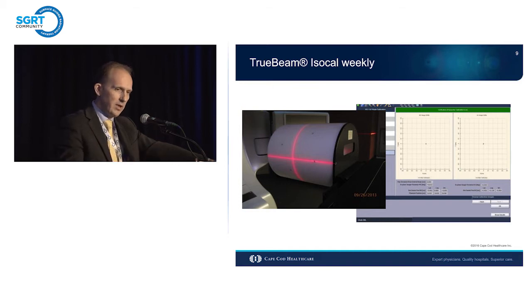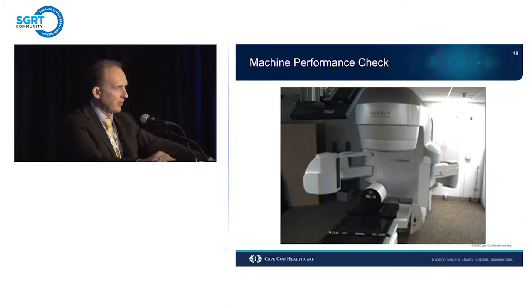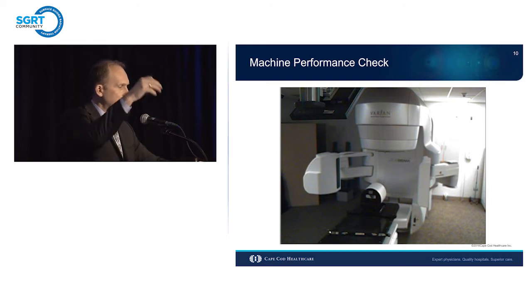And a great improvement in the latest releases of TrueBeam, around TrueBeam 2.0, 2.5, is something called the machine performance check. Now, this check in the morning, we kind of move away from the usual output check, flatness symmetry check, ISO-cal type check, because this module itself, using the MV imager, the KV imagers, and the delivery system, and that phantom in a pre-programmed position, will verify all these things.